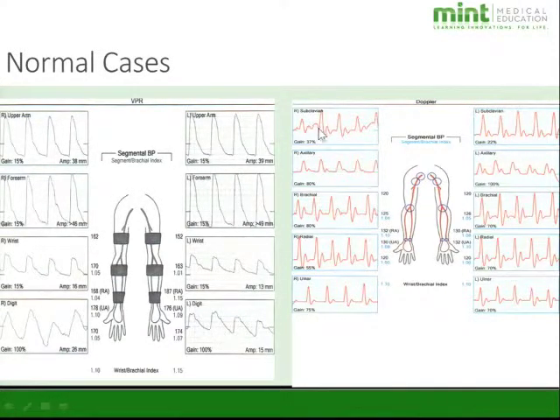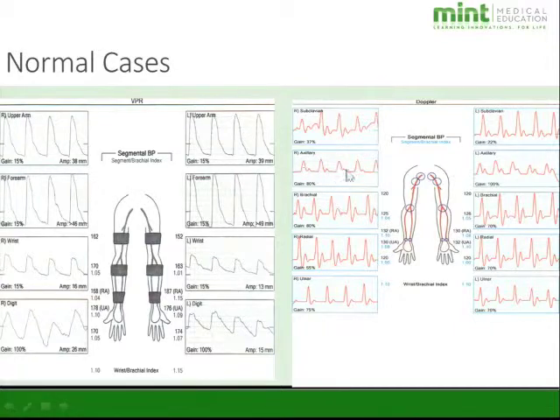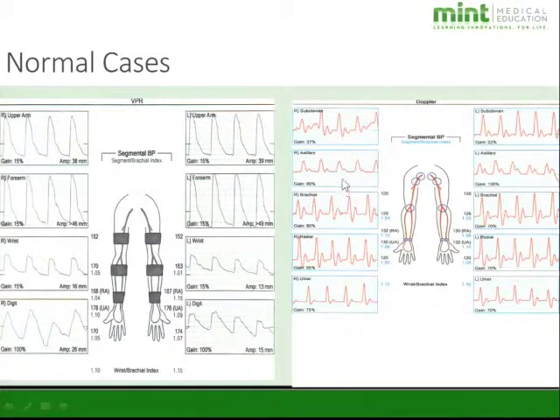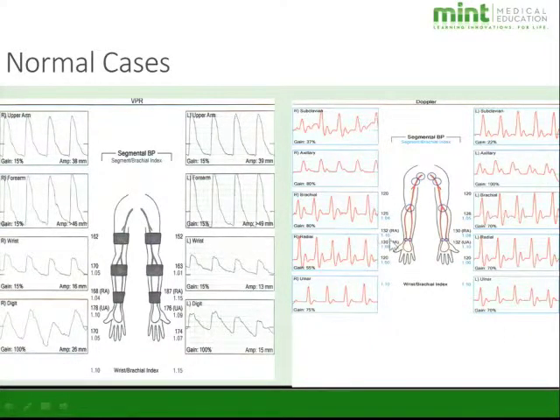Here's an example of a Doppler case with a triphasic waveform — 1, 2, 3 — and one that is almost tetraphasic with 4 peaks. At the axillary level, the waveform doesn't quite drop below baseline, probably due to Doppler angle, since it's difficult to get a good angle in the axilla. All waveforms below are normal, and normal wrist brachial indices and equal brachial pressures are seen bilaterally.